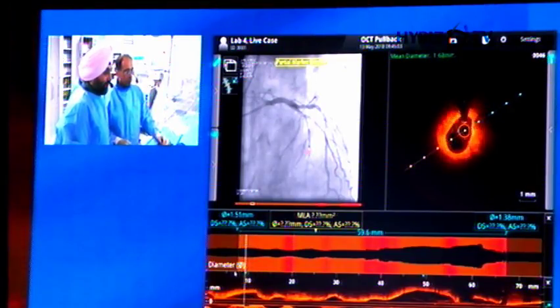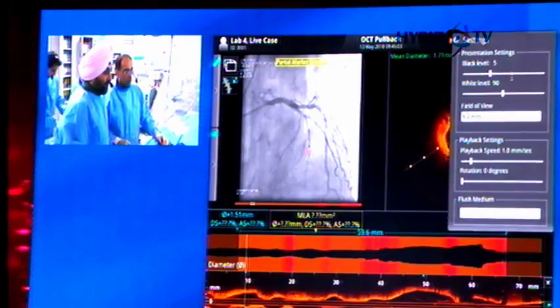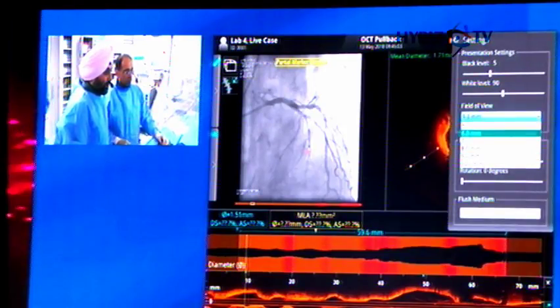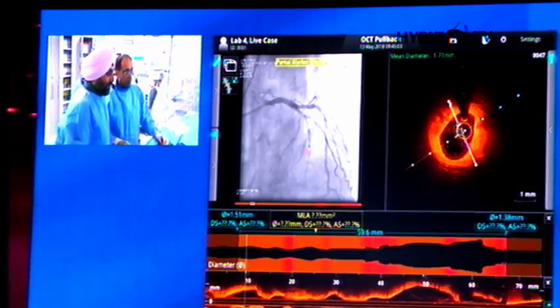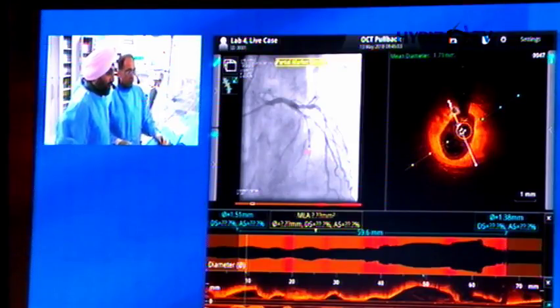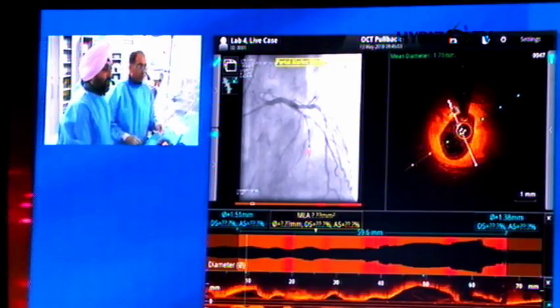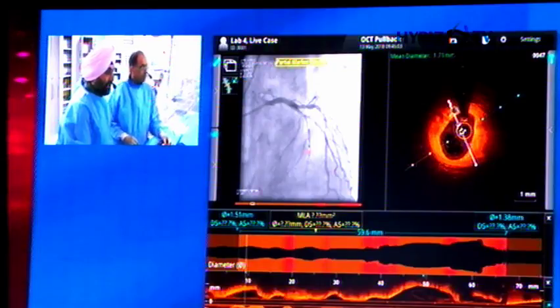We decided that we were going to act quickly and try and go distally to size, to see what size stent we were going to put in distally. We knew that we were going to have a 2-stent strategy here. So measuring EEL to EEL here, we can see that the vessel size distally was 3.12. Understanding that this is a very atheromatous vessel, if we put in a 3.0 stent distally, we would have actually had a bulge at the end of the stent.